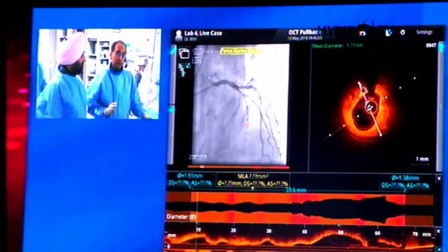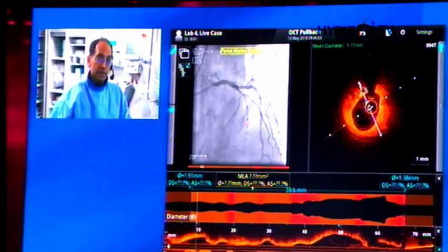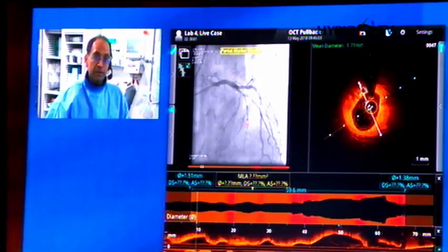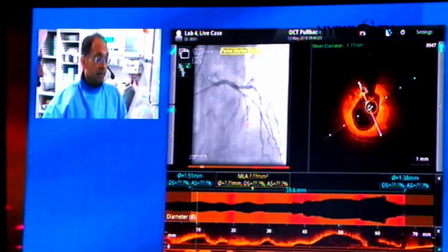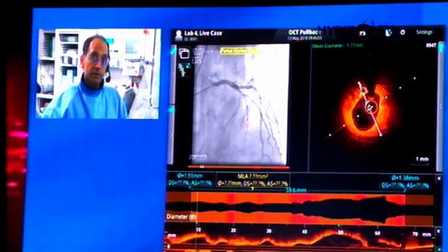The Sierra is a general stent. You can go from 2.5 onwards to 3.25, same stent. 3.75 diameter. So we could have been generous with the stenting, but here we just knew we needed a bigger stent. The OCT helped quite significantly in sizing the distal reference.